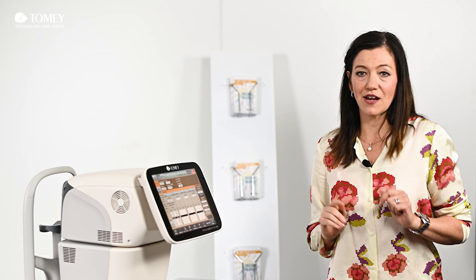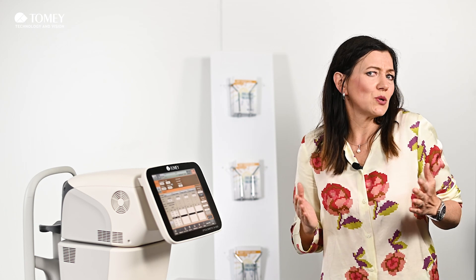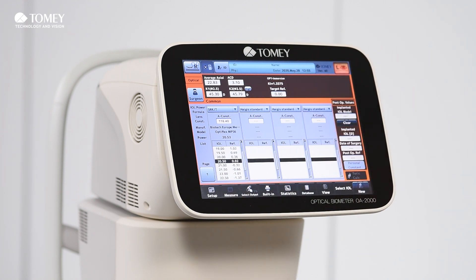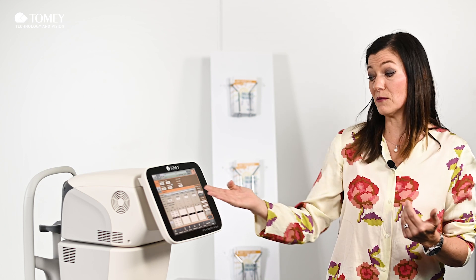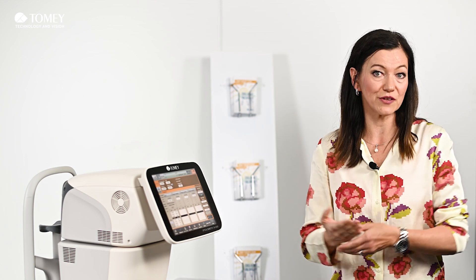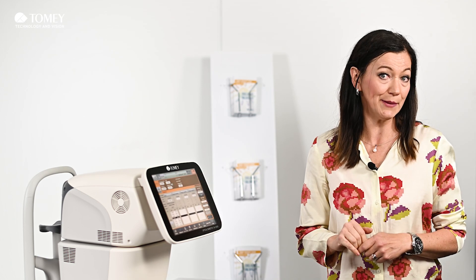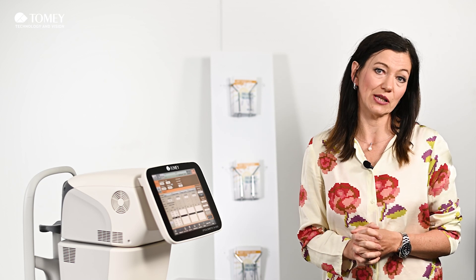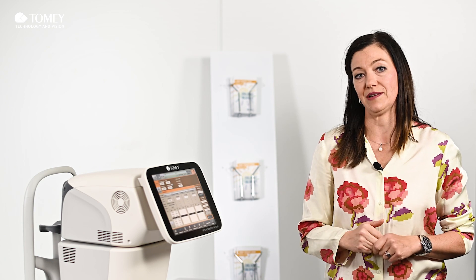When you share this OA2000 in a big clinic, you are also able to customize the IOL sheet to your needs. You can enter surgeon names and their favorite formulas with also their favorite IOL models, and then you simply change the surgeon name and you have your favorite formulas and IOL models included. This makes it a little bit easier.